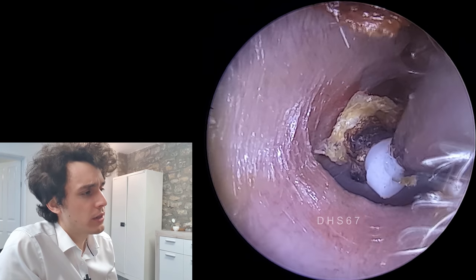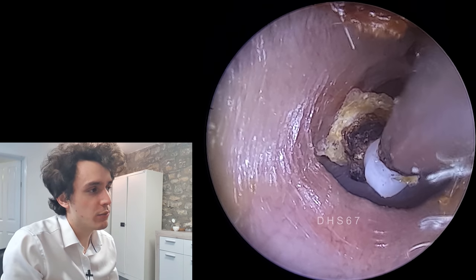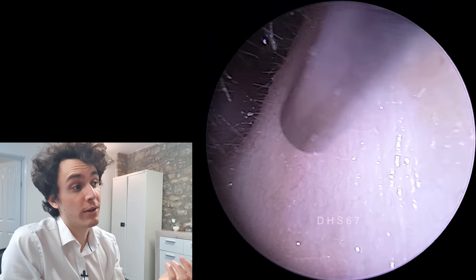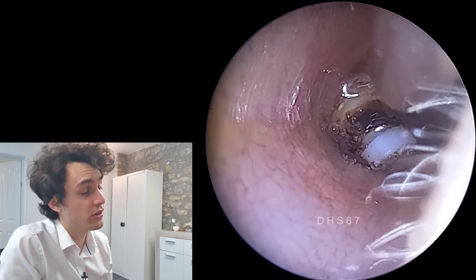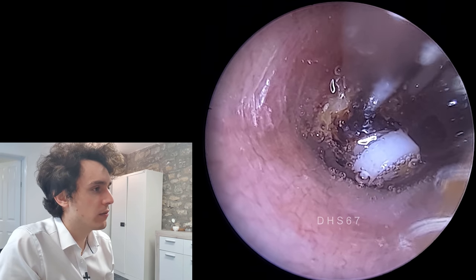What we're going to do now that it's mostly unstuck is apply some olive oil. The olive oil will allow me to actually latch onto the grommet and will also allow it to slide away down the ear canal without much friction. So there we are — a fairly generous amount of olive oil drops.